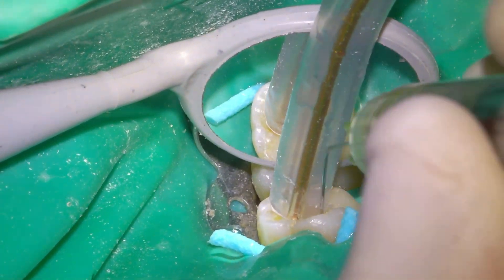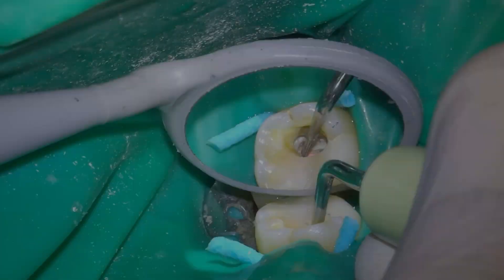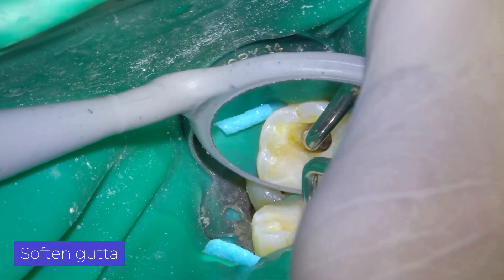Always irrigate after using the ultrasound, either with water or hypochlorite. Another way to soften gutta-percha is with ultrasound tips.